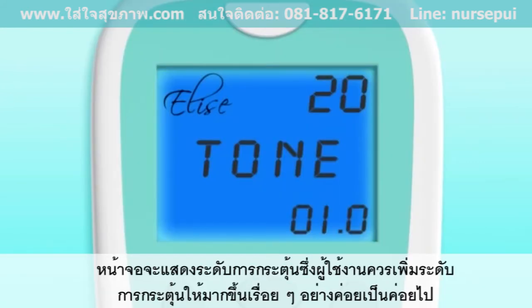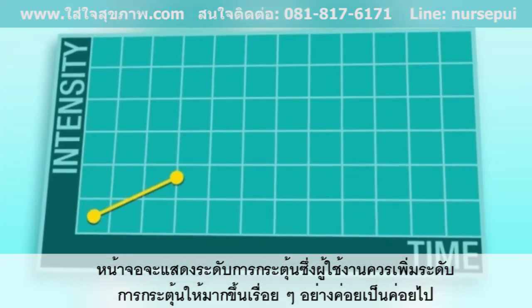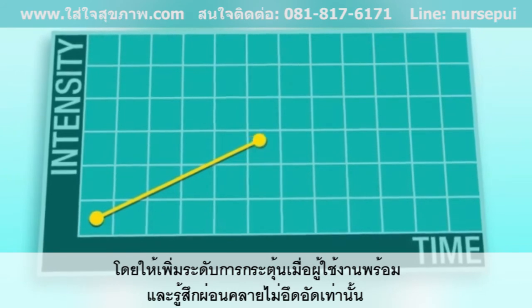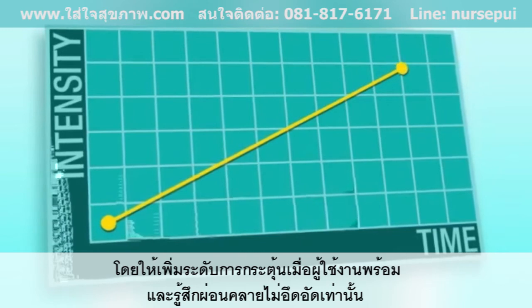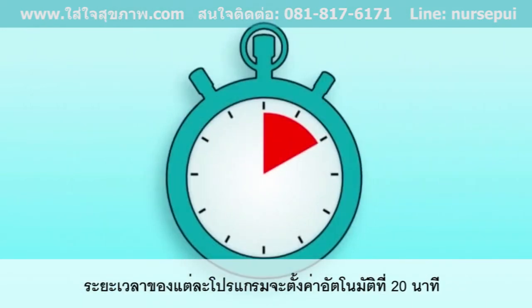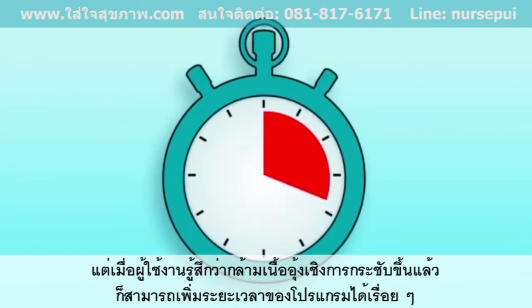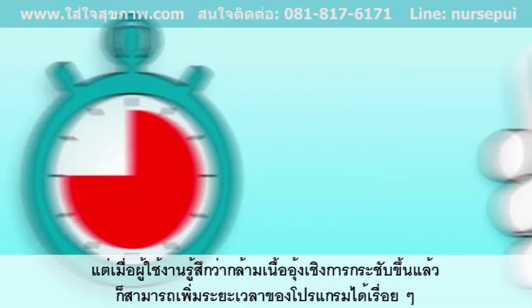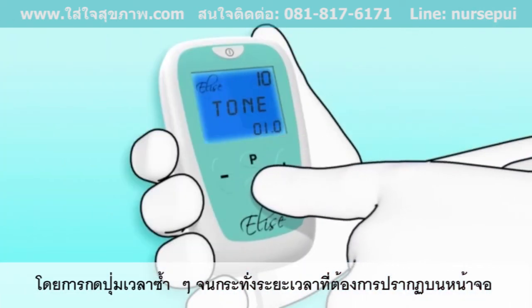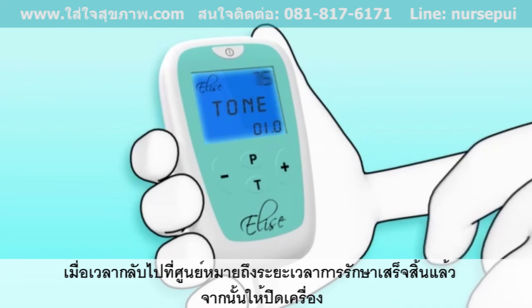The screen will display the current intensity, and you should aim to increase the intensity you use over a number of days. But remember, there's no hurry, so only increase the strength of the stimulation as and when you're comfortable and ready to progress. The length of each session is automatically set to 20 minutes, but as your pelvic floor muscles begin to strengthen, you may want to increase the duration of the sessions. To do this, simply press the Time Selector button repeatedly until the desired duration is displayed on the screen. When the timer reaches 0, your session is complete.